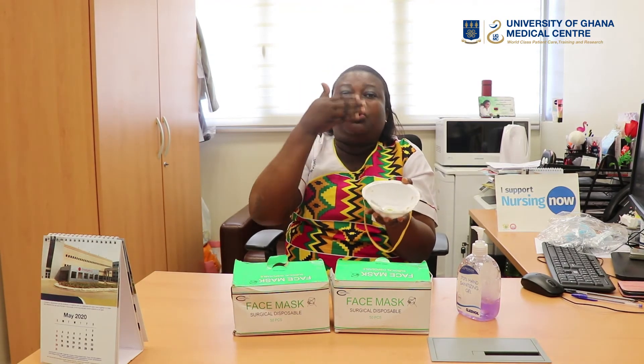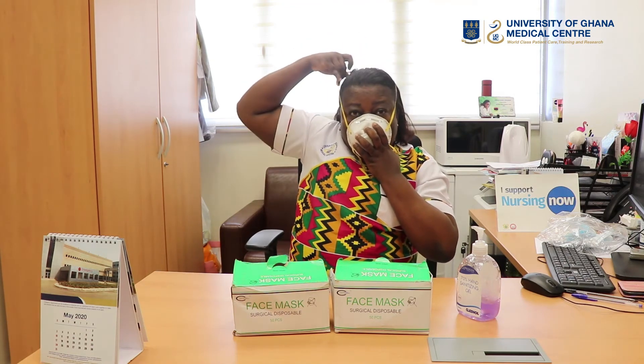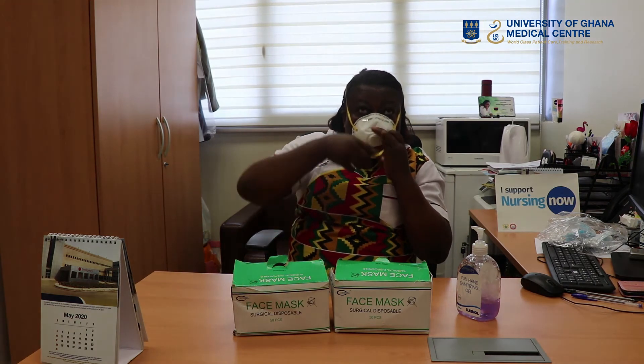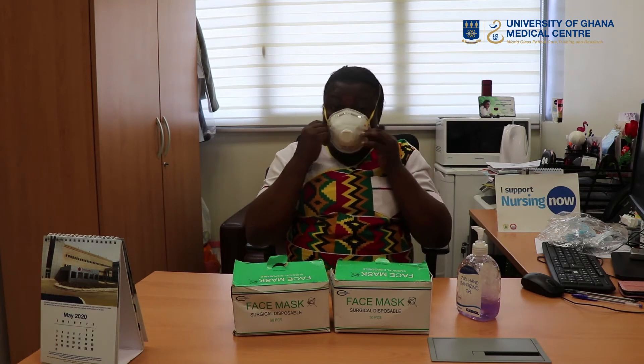The string will fall on the bridge of the nose. You bring it towards your face, then take the first loop — it comes here like this. Then pick the second one, which will also come like this, down.